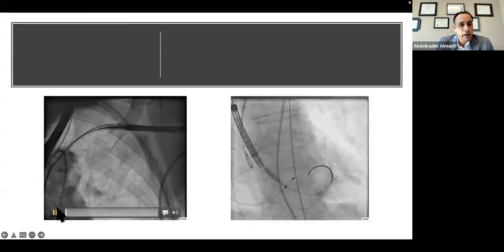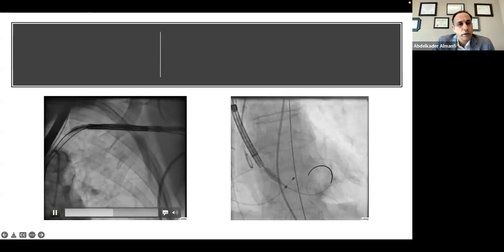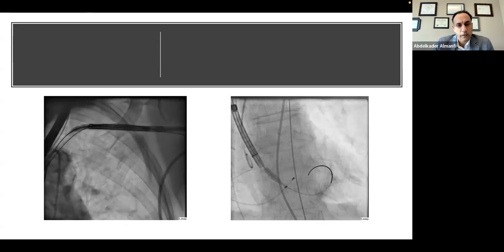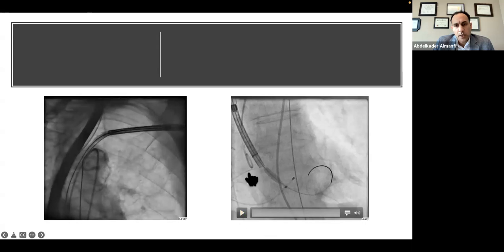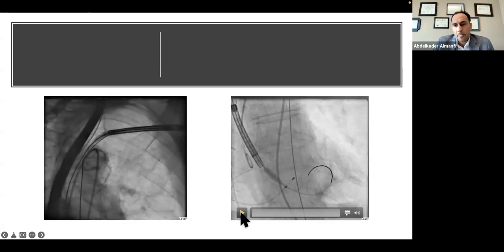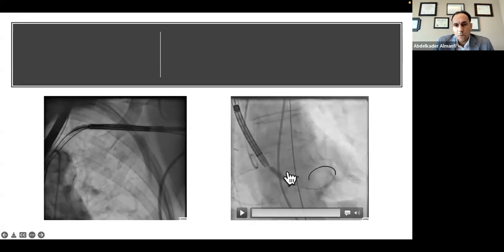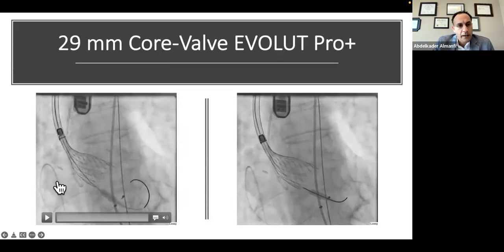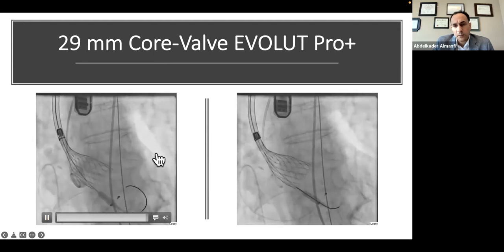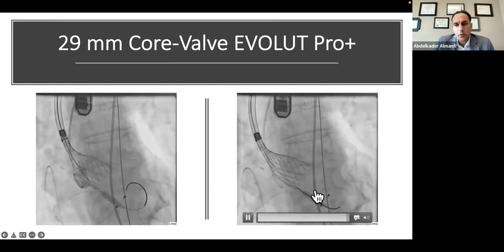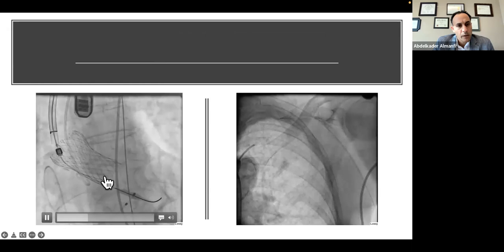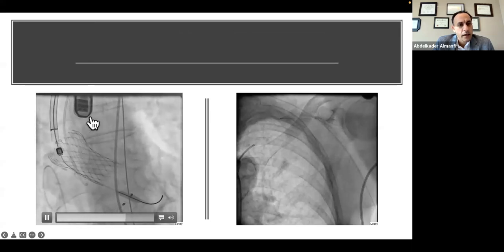The next step is advancing the valve system. In this case, we performed TAVR with an Evolute Pro Plus valve, size 29, based on the CT scan. We have a pigtail from the femoral artery, 6 French, and we use the cusp overlap technique. The valve is deployed up to 80% — we had good depth and no conduction issues. We then pull the wire back into the nose cone to obtain release with forward pressure from the primary operator, as in the usual fashion. The valve is released, good results confirmed with TEE and hemodynamics.